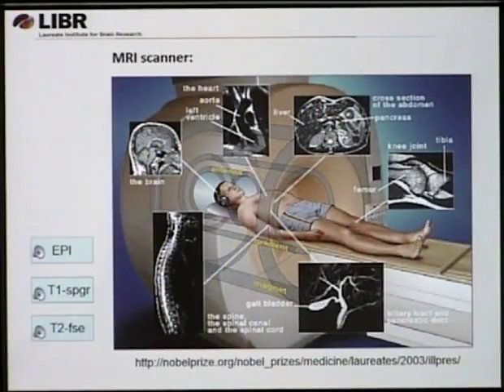But anyway, there is noise generated by the scanner, so when we put the subject in, we can put in some earplugs. The noise is not dangerous, but some people don't like it. For some people it's annoying, so we can give you headsets and earplugs so you can listen to or watch a movie. Some people don't even notice the noise, but for some experiments the noise is noticeable.